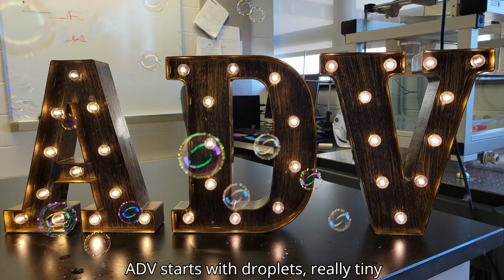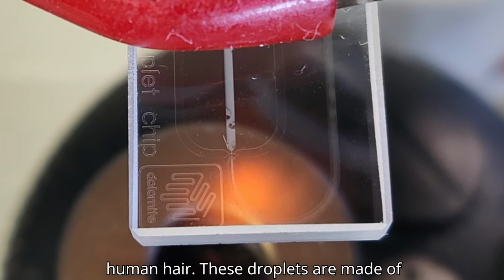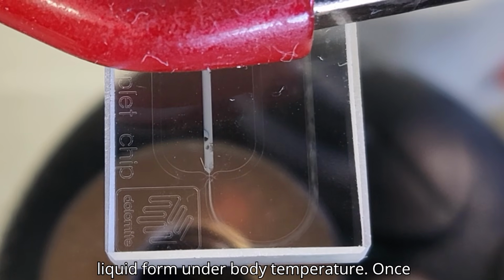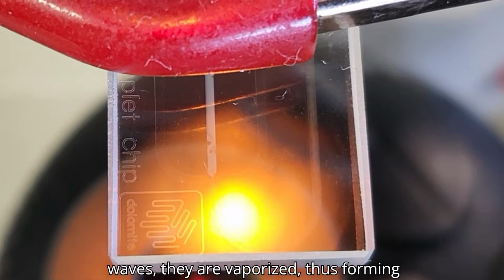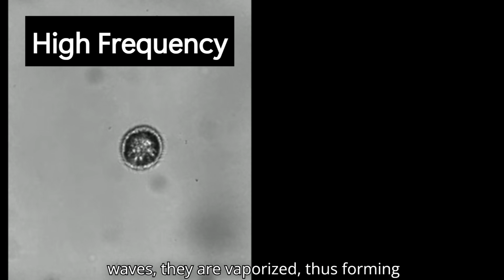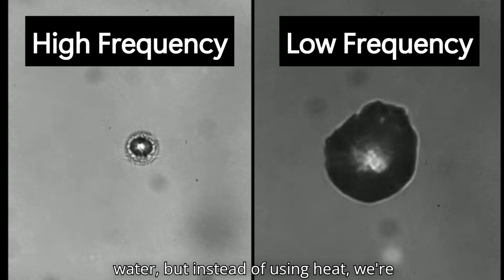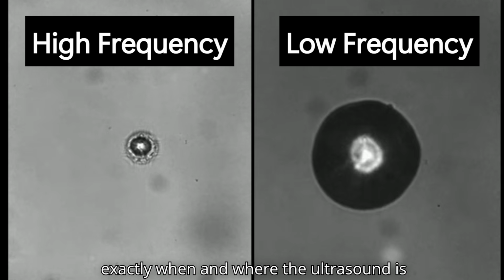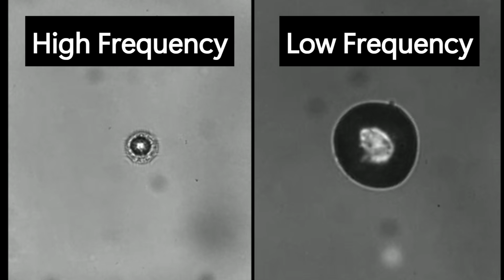ADV starts with droplets, really tiny ones, much smaller than the width of a human hair. These droplets are made of perfluorocarbons, which normally are in liquid form under body temperature. Once these droplets get zapped with ultrasound waves, they are vaporized, thus forming gas bubbles. It's kind of like boiling water, but instead of using heat, we're using sound. As these bubbles form exactly when and where the ultrasound is applied, researchers can control their formation very precisely.